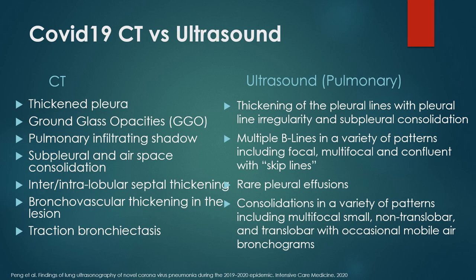However, as we all know, CT is a little bit difficult to be loaded into. You suddenly have a patient that's on restriction and isolation. And if you're at the point of care, sometimes it's good to just kind of stick a probe on.